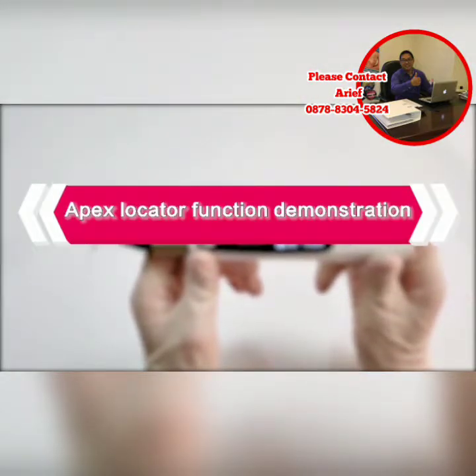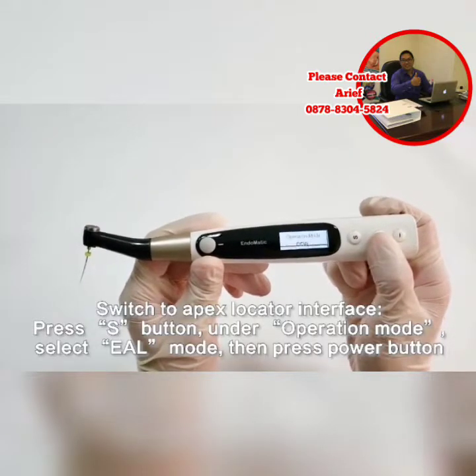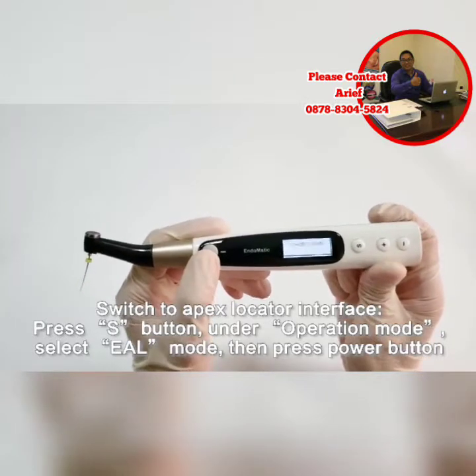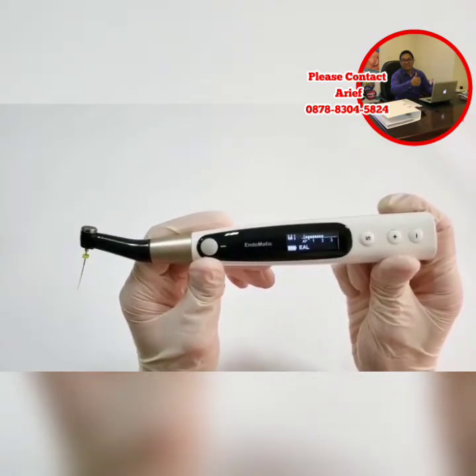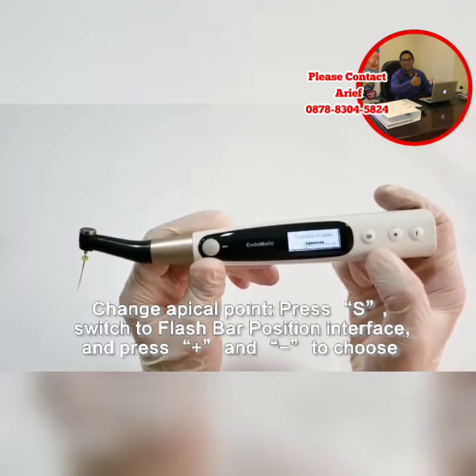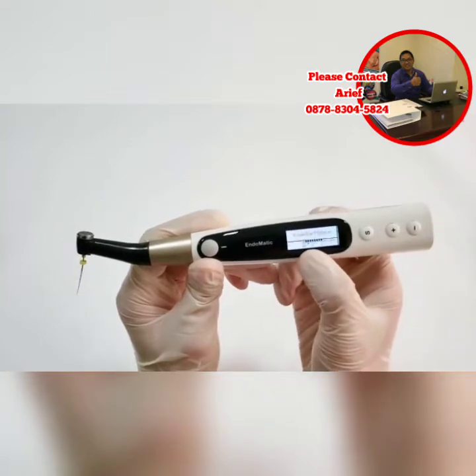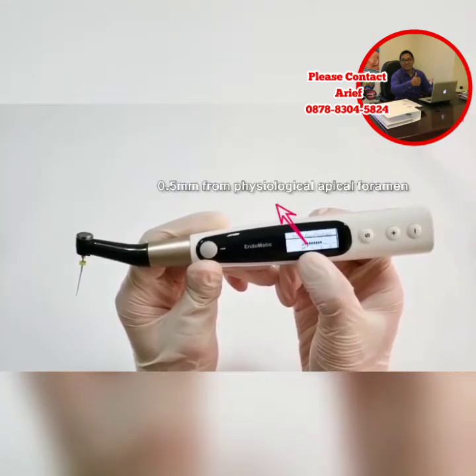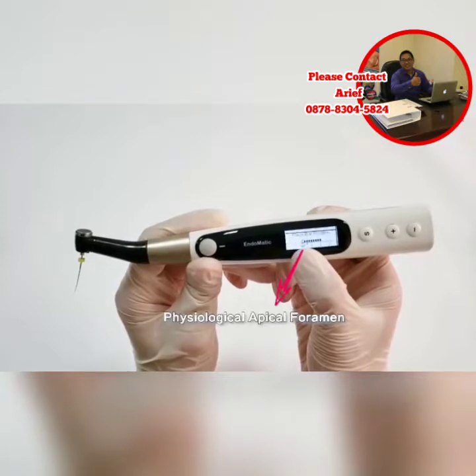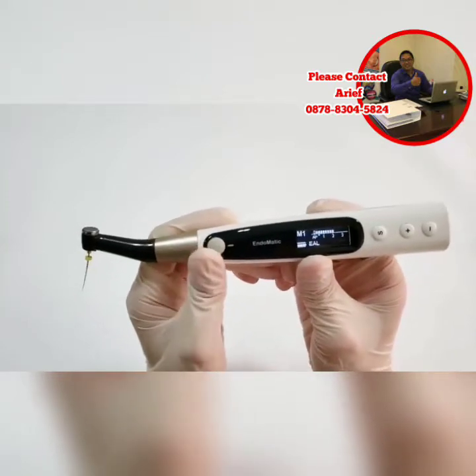Endermatic has an apex locator function. If you want to use only the apex locator function, press the S button, and under operation mode select EAL mode — EAL is apex locator mode — then press the power button. We will then see the apex locator interface. If you want to change the apical point, press the S button. Under the flash bar position interface, press plus and minus to change the apical point according to your demand. Please look at the triangle icon — this is our suggested apical point, around 0.5mm from the physiological apical foramen. The AP icon position is the physiological apical foramen. Select the apical point and press the power button.